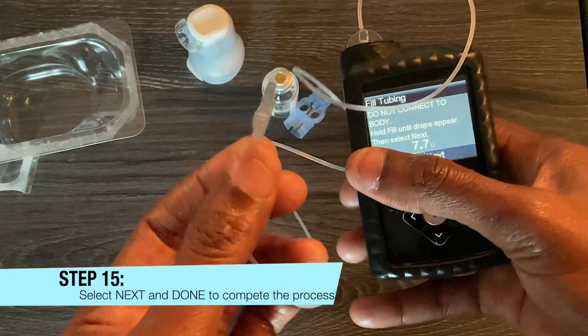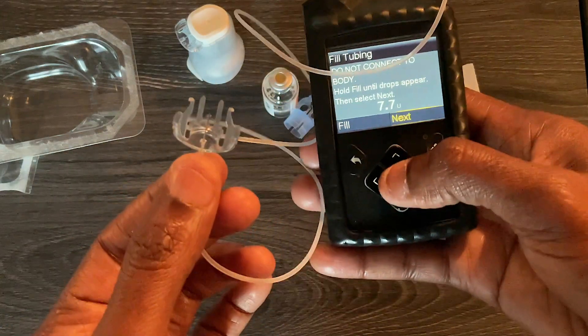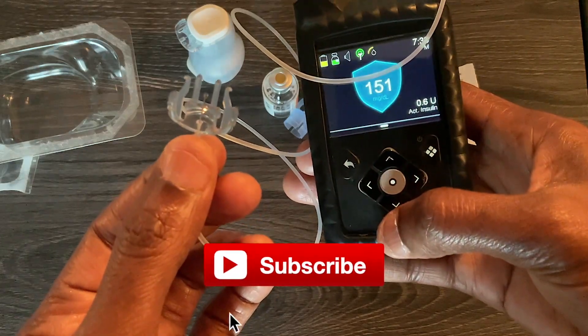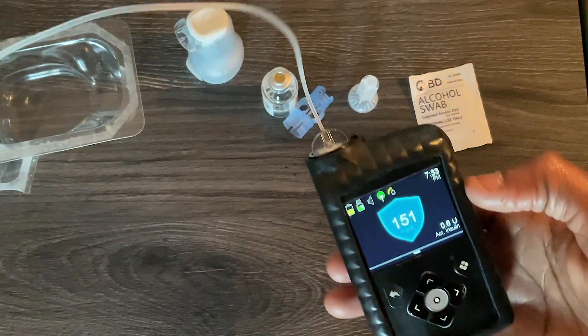Can you see the droplet right there? That's the insulin, so we know it's filled. Click Next and then Done — and that's how you refill your insulin pump with insulin.